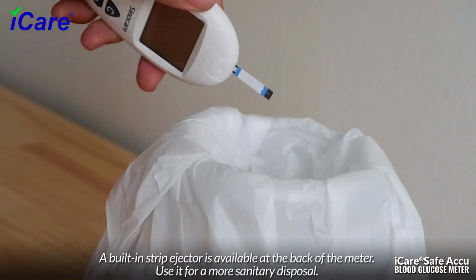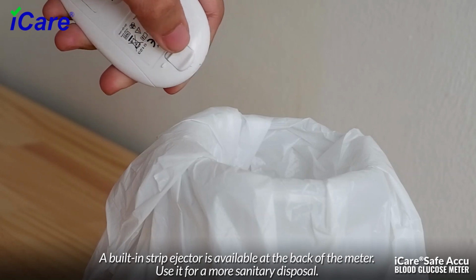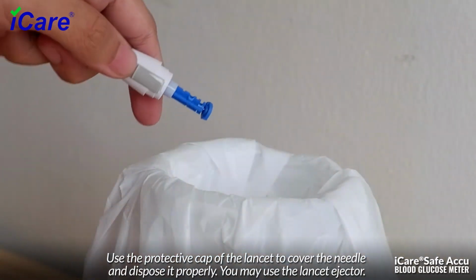A built-in strip ejector is available at the back of the meter. Use it for a more sanitary disposal. Use the protective cap of the lancet to cover the needle and dispose it properly. You may use the lancet ejector.